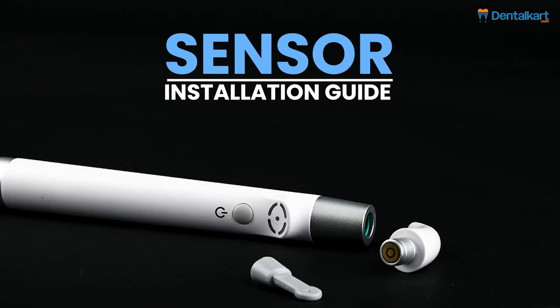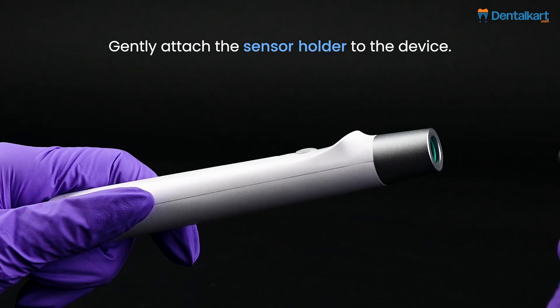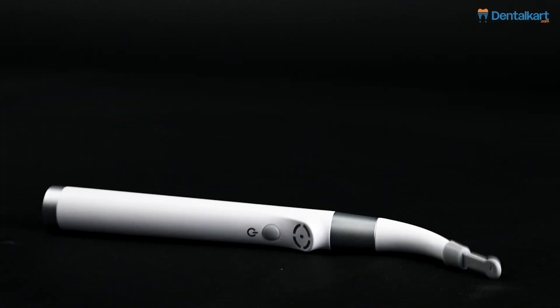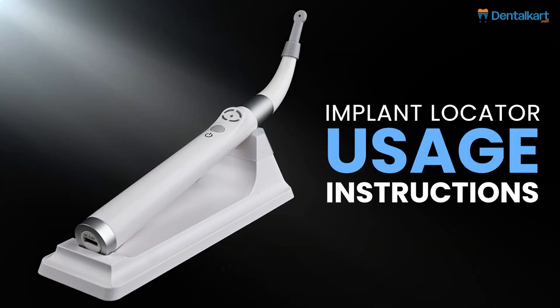Sensor installation guide: gently attach the sensor holder to the device, then insert the sensor into the holder.